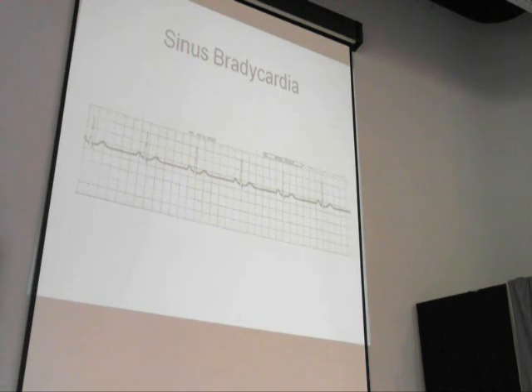Pacing. With ACLS, pacing can be temporary or permanent. And in some elderly patients, the conduction system just wears out, the bradycardia does not respond to atropine, and we must pace the heart. Put on an external pacer to apply the electricity to get us 60 beats per minute so we can do some more puzzle putting together, finding out what's wrong. And in some patients, they have to have permanent pacing before the conduction system wears out.